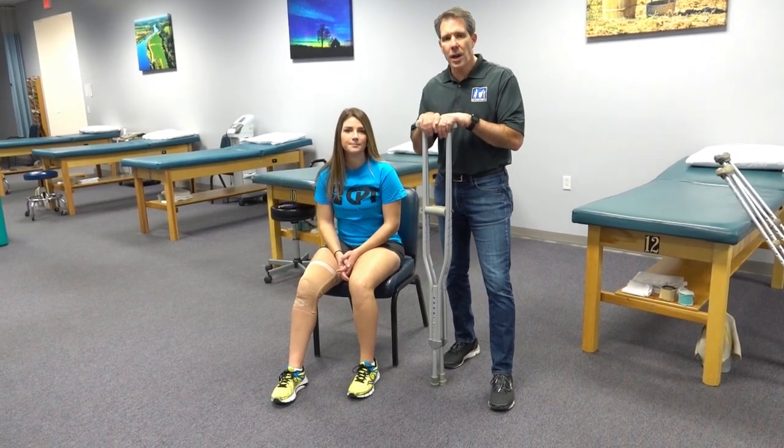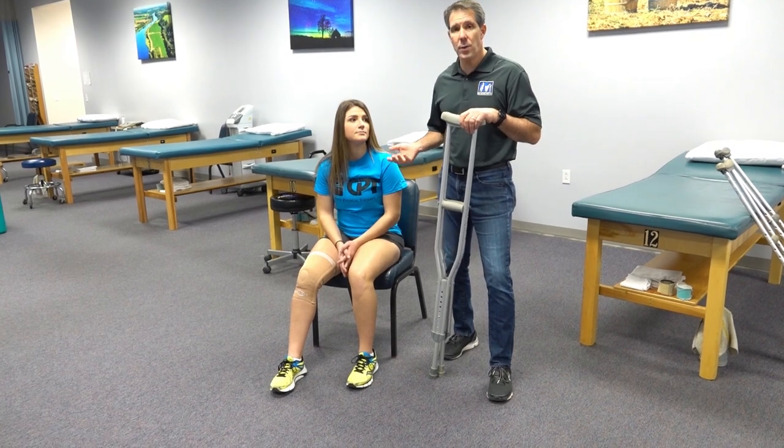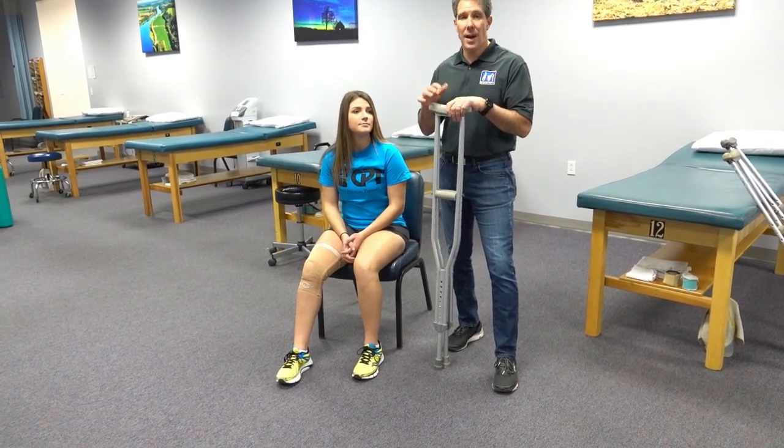Hey everyone, today we're going to be talking about how to get up out of a seated position out of a chair — with and without armrests — while you have crutches.